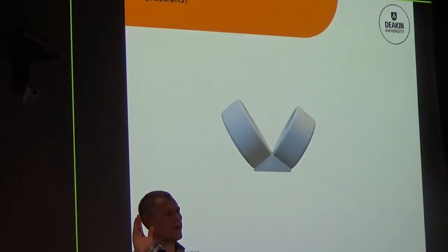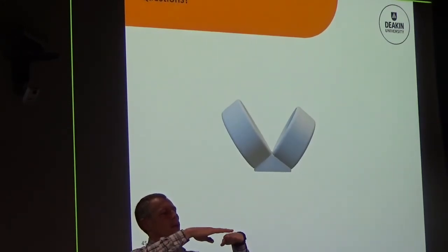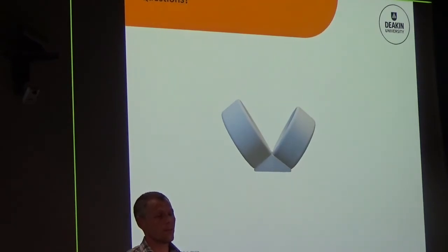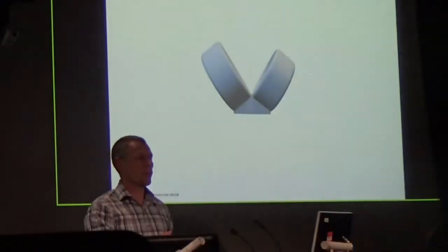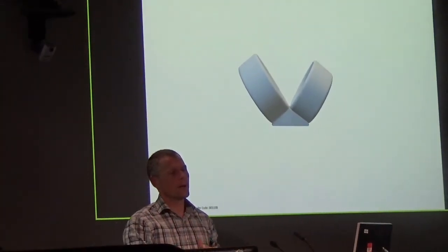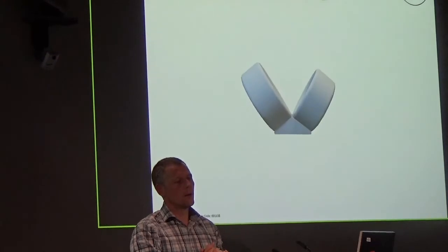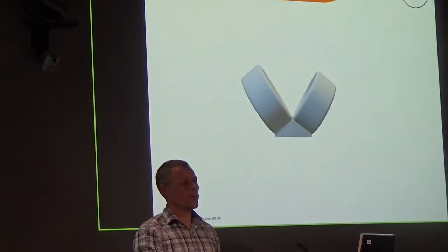So speed for this, the way this printer works, which I've shown in another video, is basically layer by layer. It puts down a layer of plastic, then moves up, puts down another layer of plastic. There are so many other printers out there. Some are literally a dust bowl, and a laser heats up the spot in the dust that needs to be solid, and then the dust drops away, and you're left with the object. They're doing it in minutes for objects, and they're not that expensive either. They're dropping the price a little bit. The HP ones are really expensive, but they're quick. I haven't played with one, so I can't give you an exact amount. But we're talking about a reduction from 20 hours it used to be. We're talking small periods for small things like this.